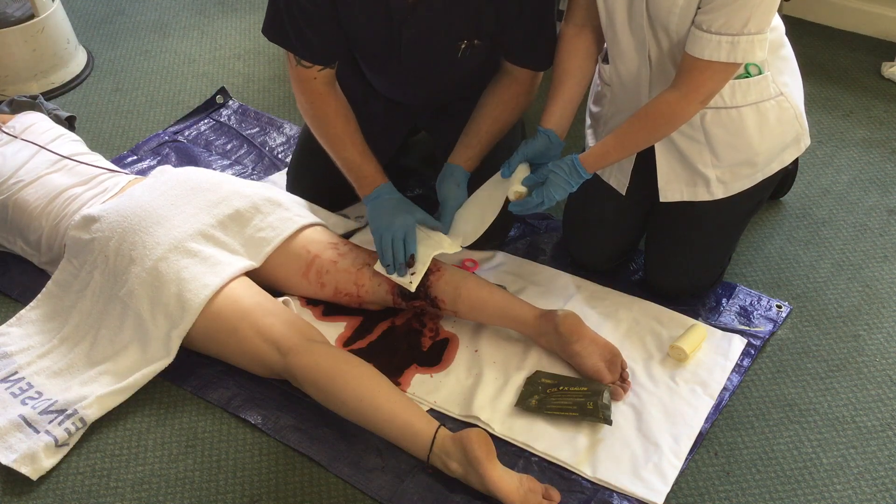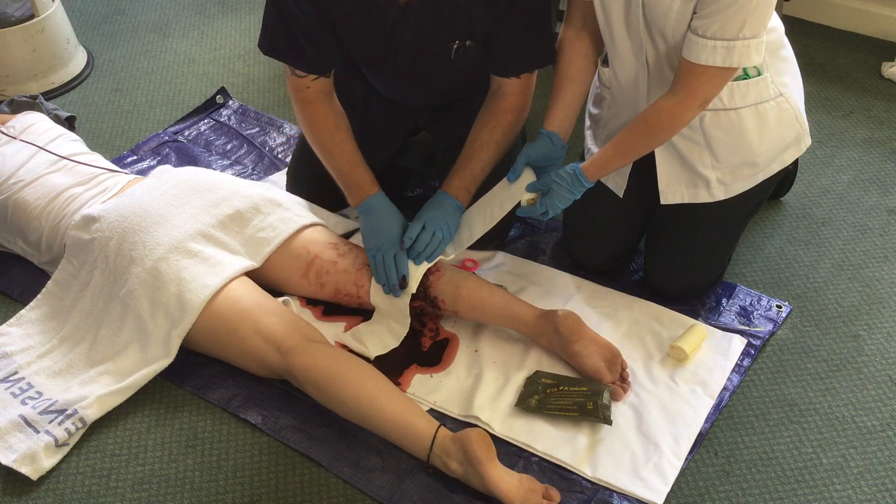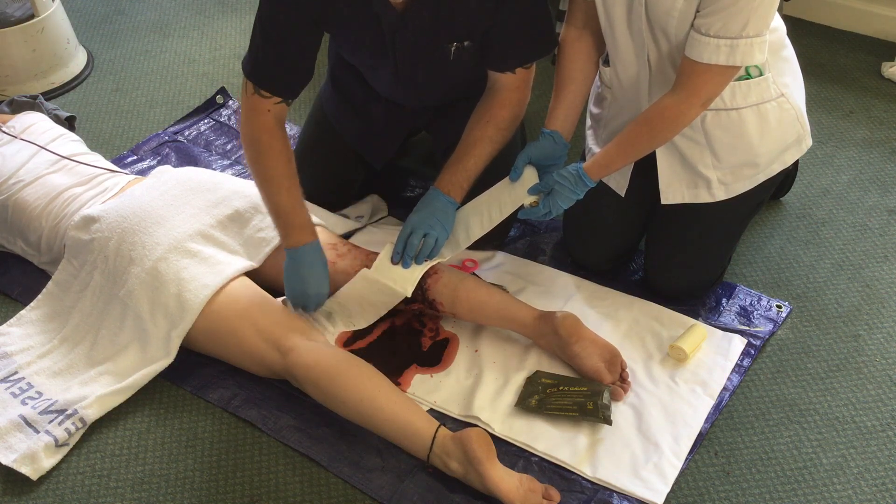If hemorrhage still continues, then more CELOX may be placed in the wound and further pressure applied for a further five minutes.